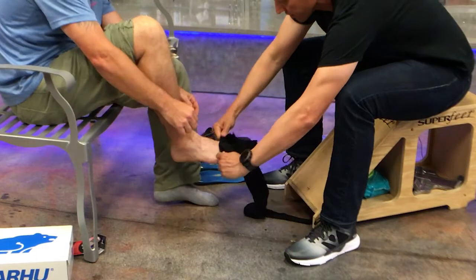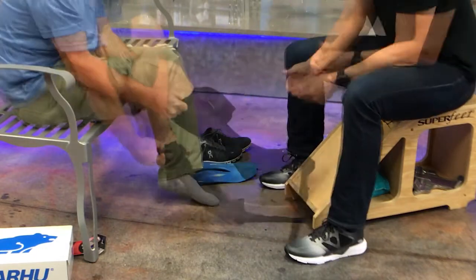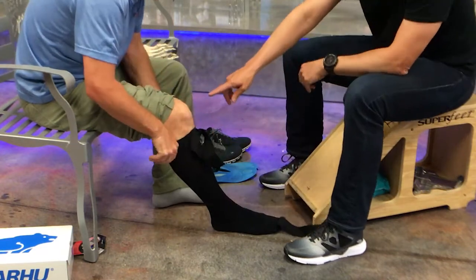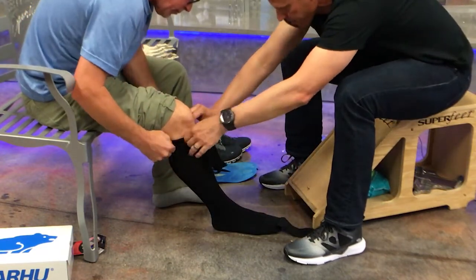I'm going to slide it on over your foot. I'll give that to you and you can go ahead and bring that up. You want to bring it up against the toes. And bring the top part of the sock up just as high as you can up above the thick part of the calf there.